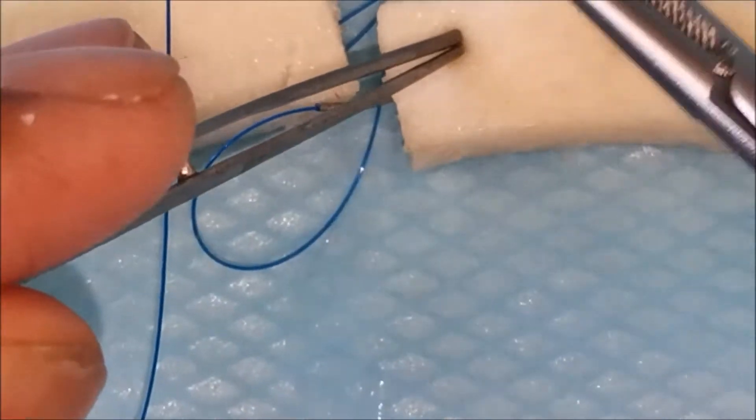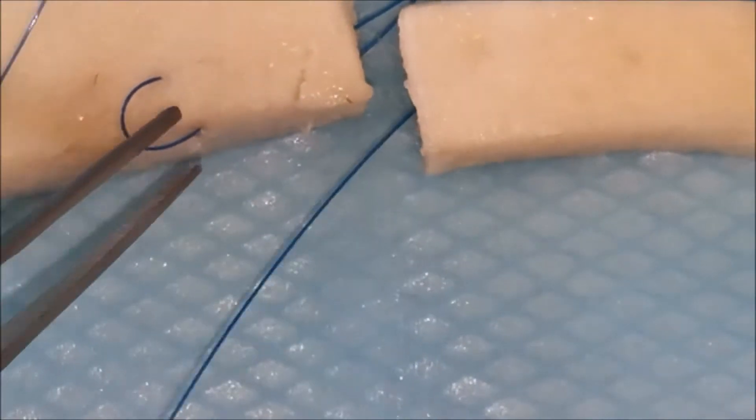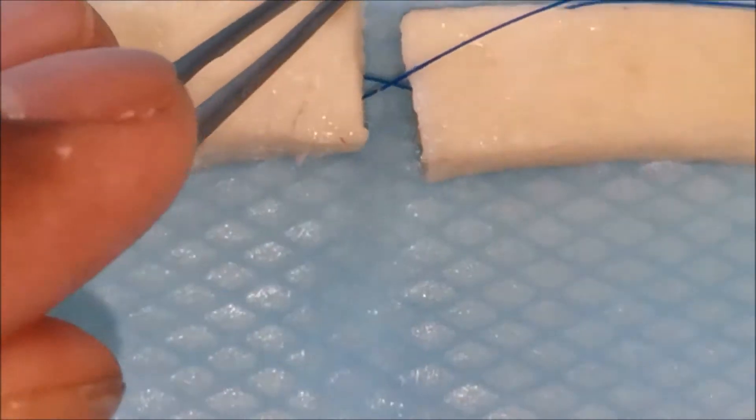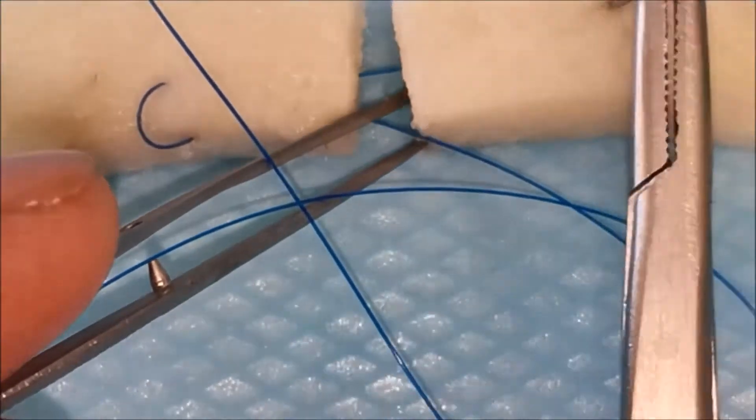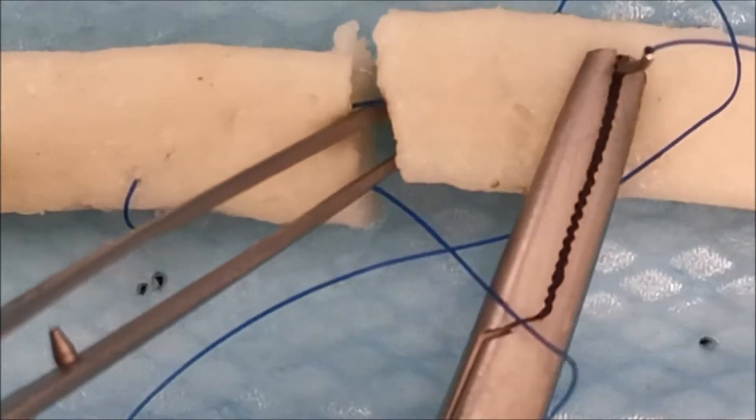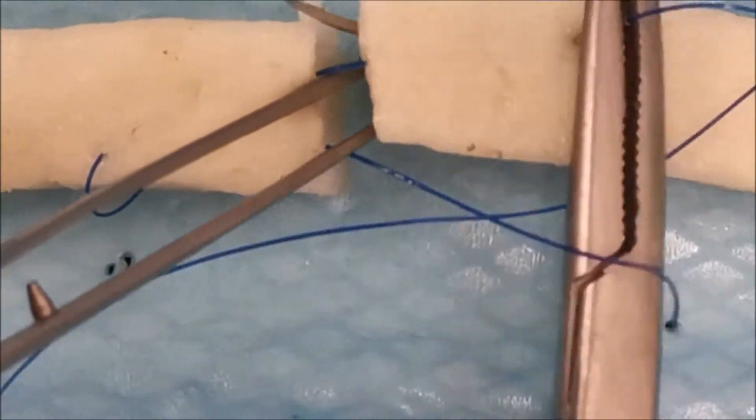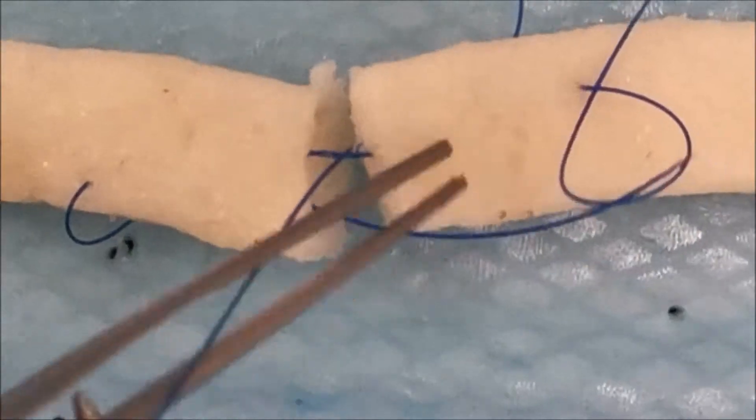This comes out the side away from you. Then when you go back in for the longitudinal suture, ensure again that you take at least 25% of the circumference of the tendon in order to grasp enough fibers.